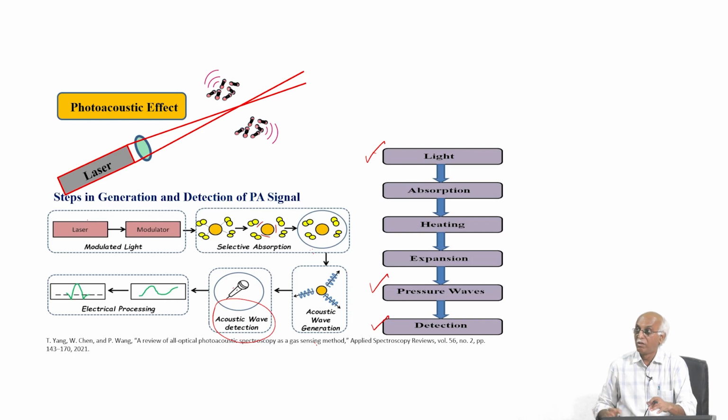Over and above, these acoustic waves can propagate through the tissue cells. The scattering of the acoustic signal in the tissue is not significant, and because of that you can capture the information efficiently using this photoacoustic technique. So, on Wednesday we will see how we can make use of this photoacoustic signal towards some measurements for biophotonics. Is it okay? Okay, then thank you very much.